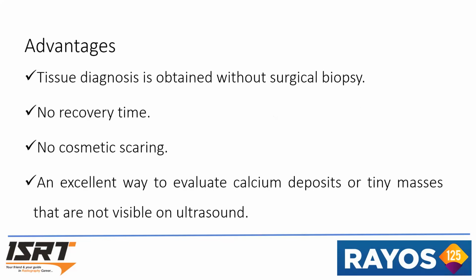Next are the advantages. One of the important advantages is that the tissue diagnosis is obtained without surgical biopsy. And there is no recovery time for the procedure. Compared to the surgical biopsy, there is no cosmetic scarring. And it is an excellent way to evaluate calcium deposits or tiny masses that are not visible on ultrasound.